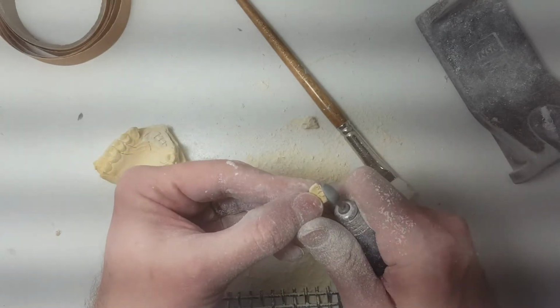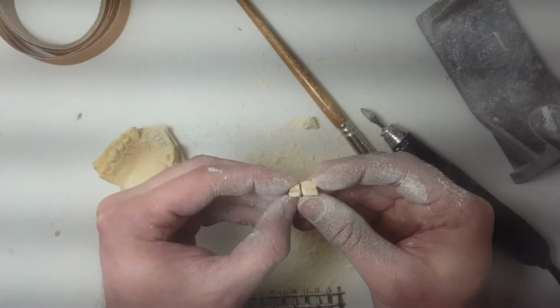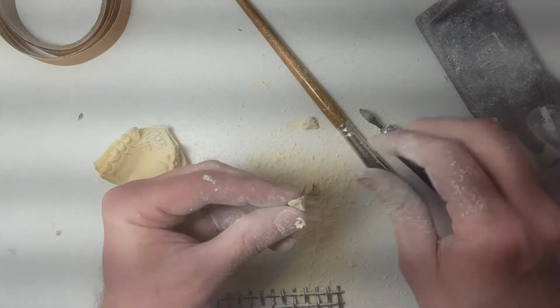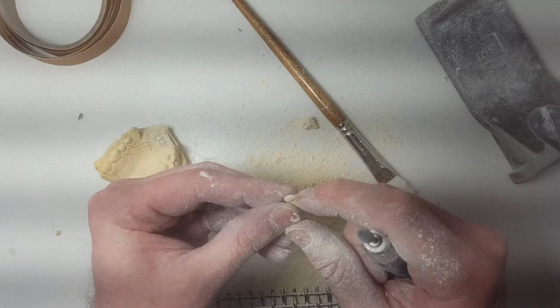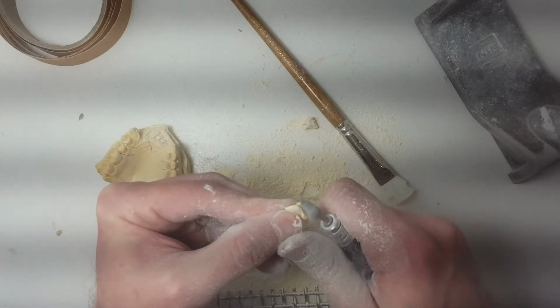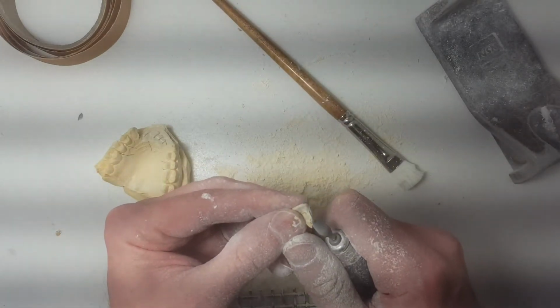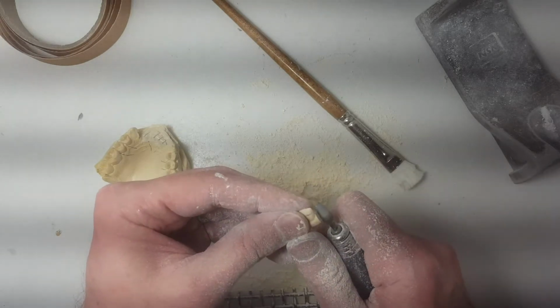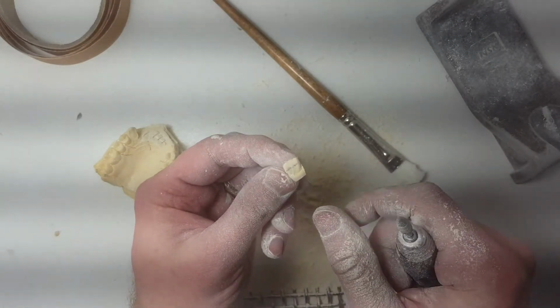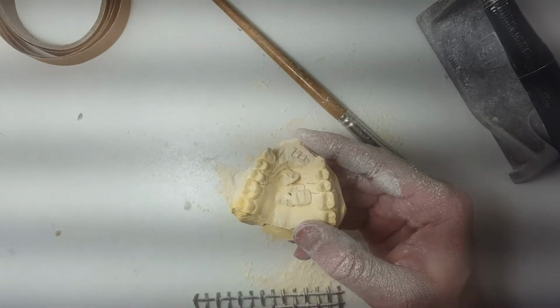Again, what I'm doing is I'm just cleaning up a little bit. This allows for you to rotate the tooth in the wax without it bumping up against its neighbor. So you see the space. You can rotate them in the wax. See how it'll bump? And I'm trying to stay away from the crown of the tooth. I'm just doing in between, the tissue part. And this is the angle when I'm holding my burr to try to get a little bit of a taper going on here. Alright. Put these in here and we'll move on to the next.